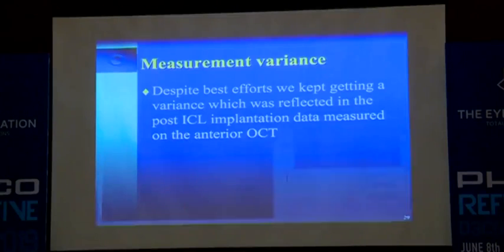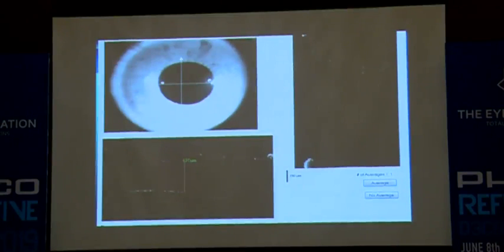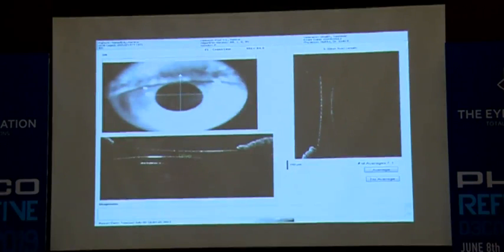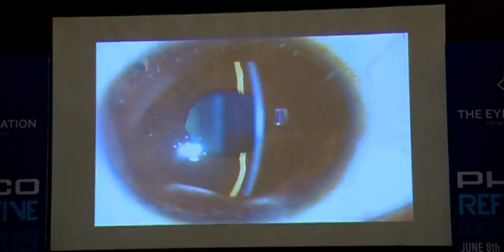Now, when you measure the variance which tends to occur, as you will notice in some of my cases, this is a 900 micron clearance, running down to 690, running down to 481. The measurements lie on the screen at the bottom, and running down to 264. And running down to 195, or 140, which I know over a period of time is going to give us trouble. So you do have to be careful with these high vaults.